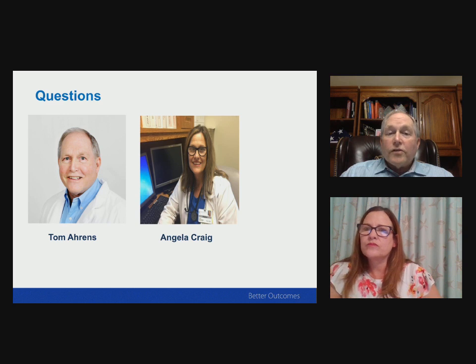The question for us as clinicians is, what are we doing with that number? So, like I said, if we have a patient whose end tidal drops, something's going on with blood flow in their lungs, assuming they're not just hyperventilating. And if it goes up, we've done something to interfere with ventilation, or the person's going into respiratory distress.